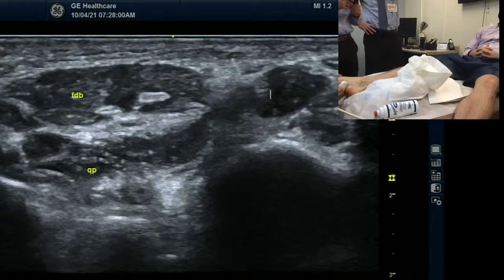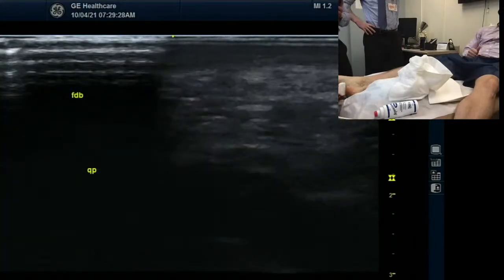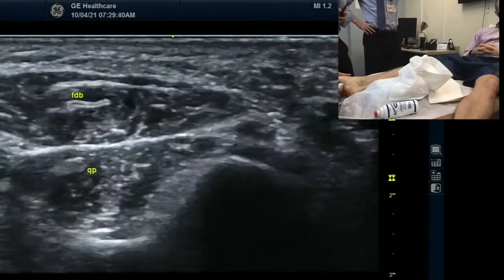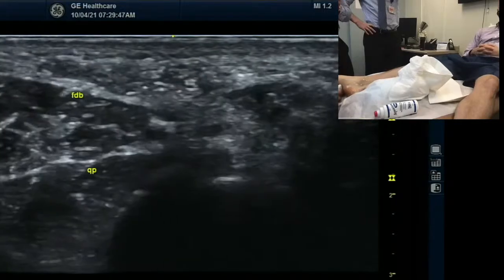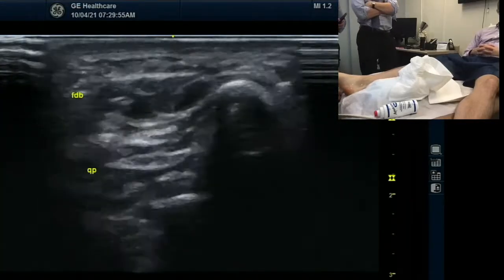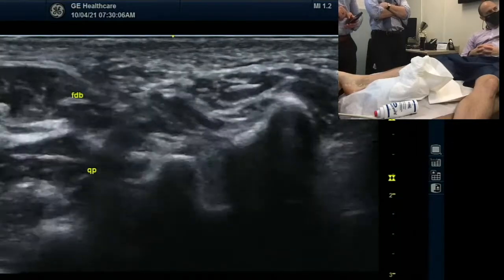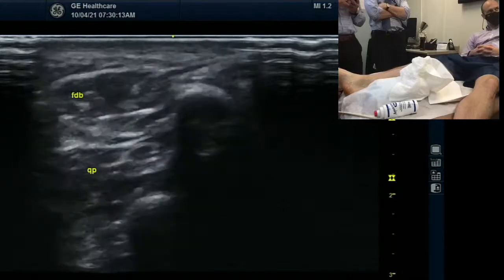So let me take a look — we'll scan along the way. There are four. So this is new territory, right? I don't think anyone I've seen has scanned it. So I want you to learn something and try to study this. So this is FDB, QP. This one on the right side — abductor digiti minimi maybe. I think that might be flexor digiti minimi. Because on the side here, that's abductor digiti minimi. You did not know you were going to be a toe model.